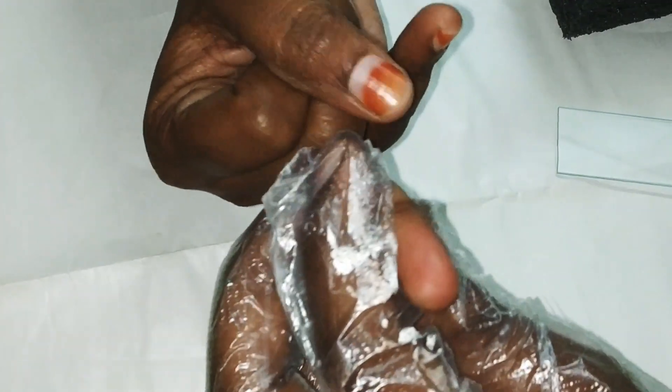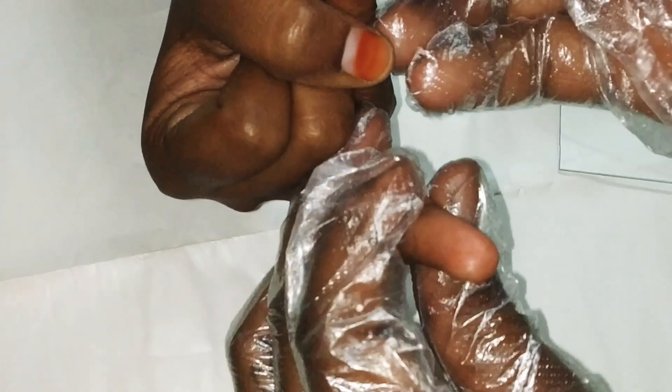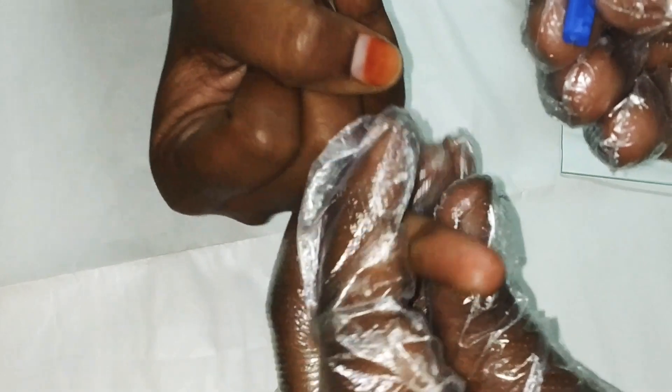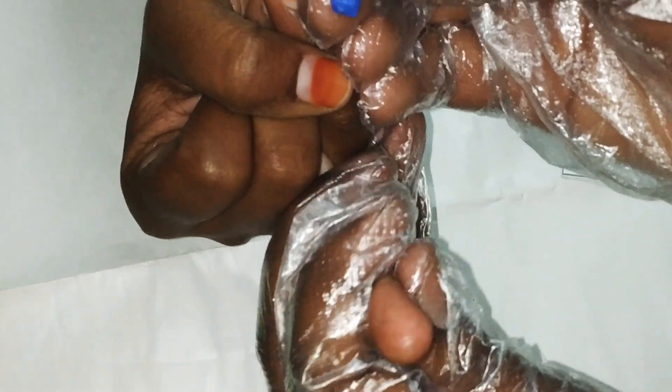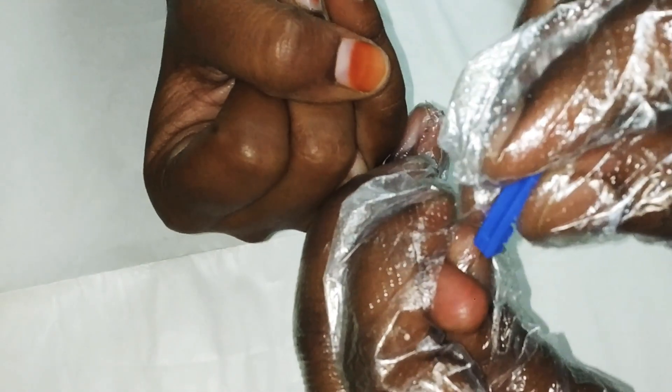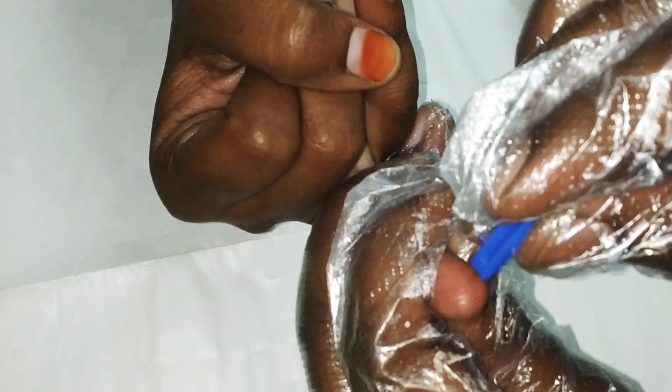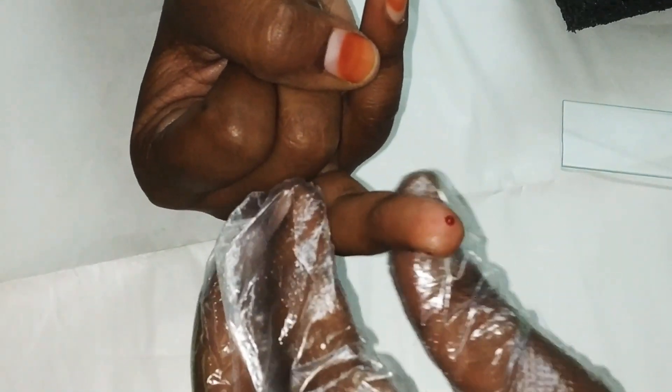Now it is completely clean. So now we are taking a fresh lancet. Here we go. We are going to catch the finger of the patient, the ring finger. Hold the finger tightly because the patient will have some fear and they can pull their finger back. Make a gentle puncture. Yes, so collect three drops of blood on a fresh glass slide.